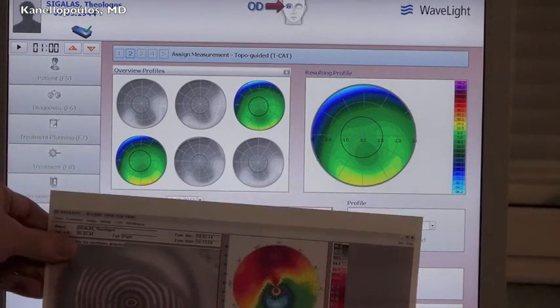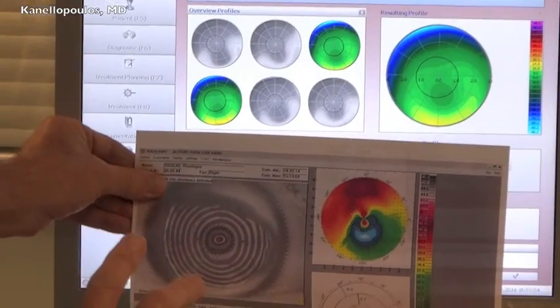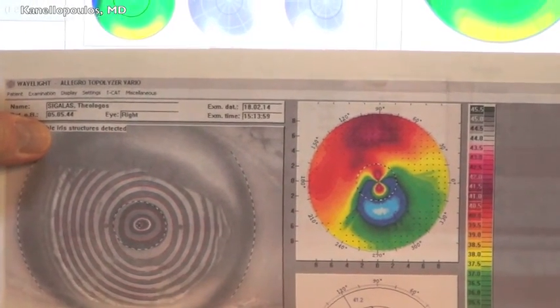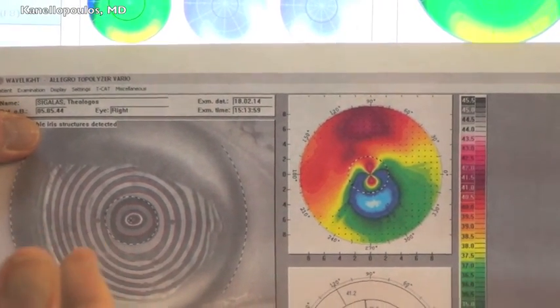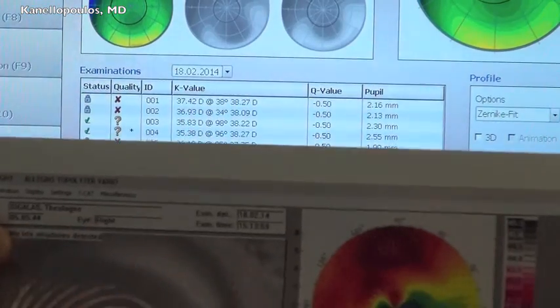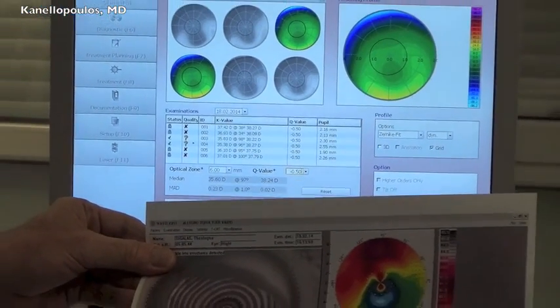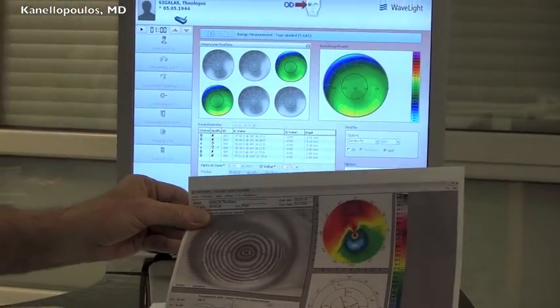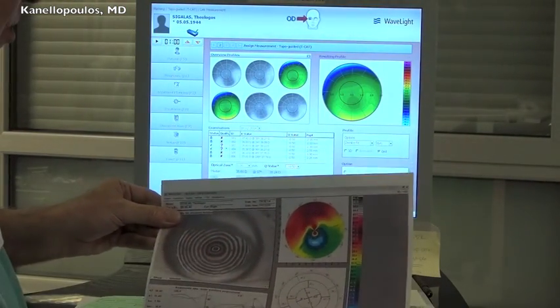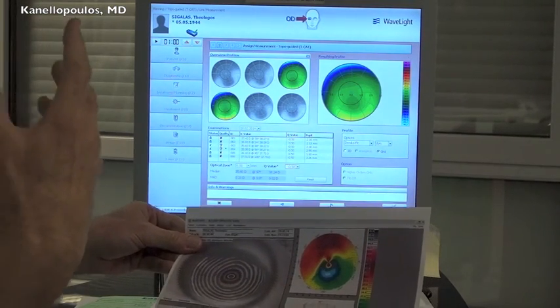And just a point for the technical side, the person that's taking these pictures usually is one of our technical staff who need to be trained to say, well, wait a minute, I have a lot of pictures with the lid in the way. So maybe it's time to tape the lid up, hold the lid up, help the patient get the lid out of the way. Sometimes these patients will have like a seventh nerve palsy or something else.